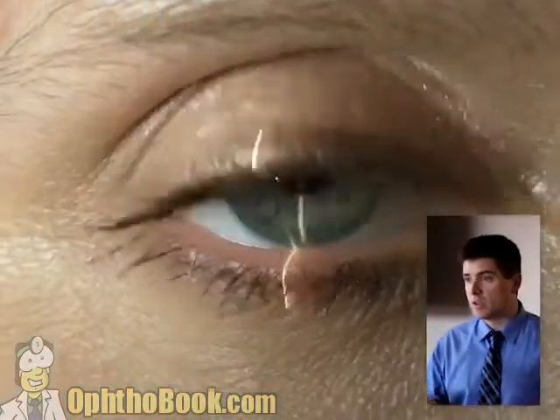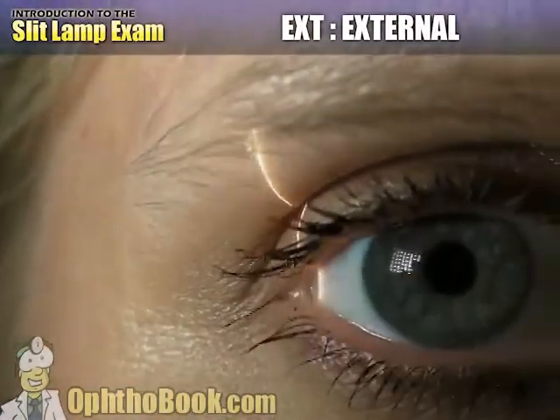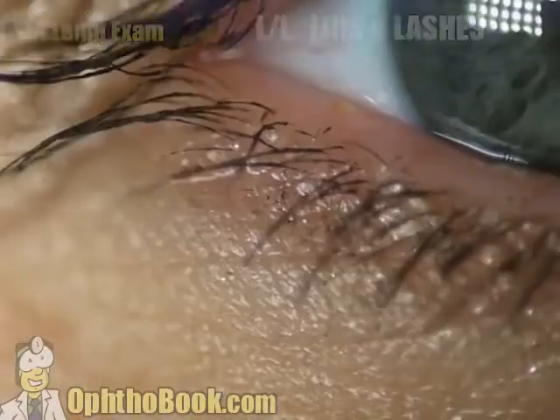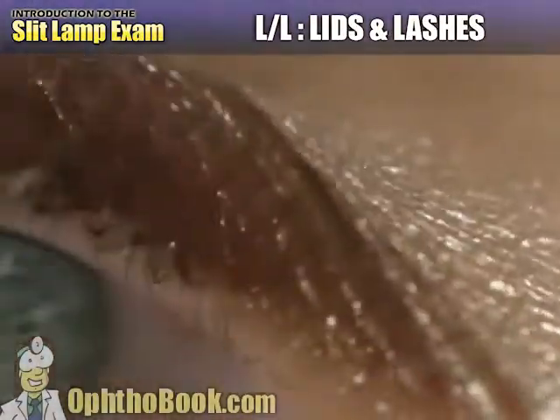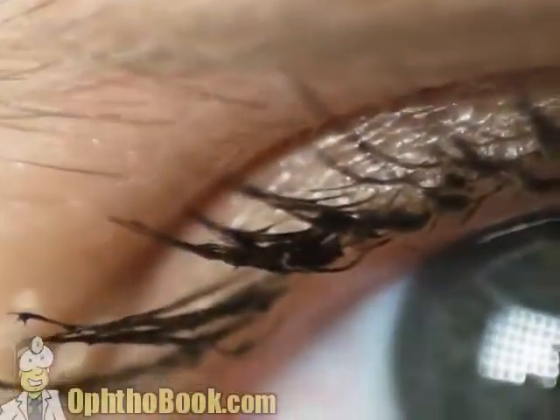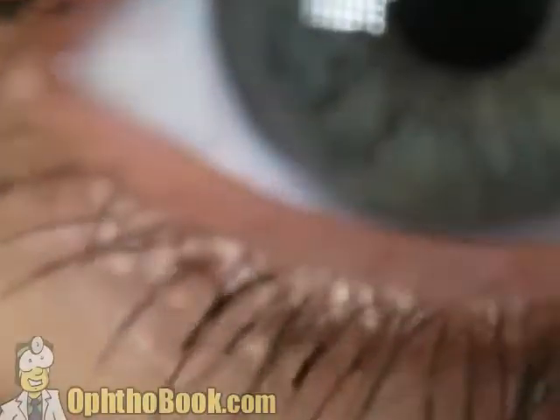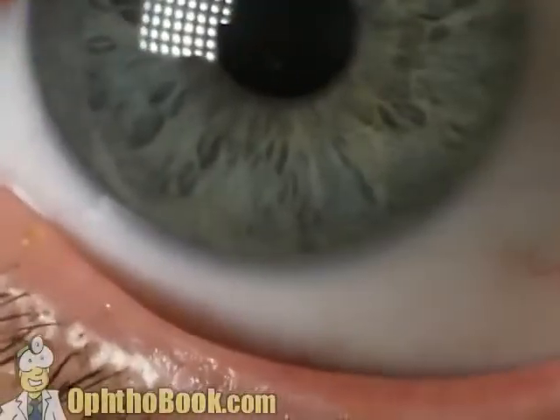Once again, we start with our external exam, looking around the eye. So we're going to look at the brow above, sweep across, we look at the nose, and looking down at the cheek, everything looks normal here. Look at our lids and lashes, we look at our lid margins, and we look at our lash line with the normal limits here. Some makeup in the corner, but that looks fine. I always flip the lower eyelid down, make sure there's no lesions there, and if they have symptoms, I'll often flip the upper, but always the lower since it's so darn easy to see.